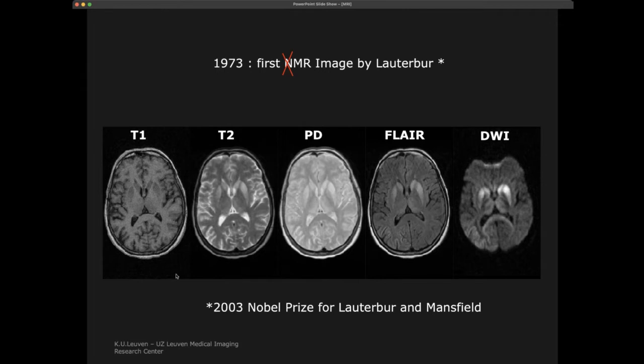What is very typical with a magnetic resonance imaging scanner is that you can produce very different images. While with a CT scanner, in principle, you have one type of image. Mostly you take one image, with contrast or without contrast, of course. You might tweak a little bit with the energy that you're using, but in principle you take one image. Ultrasound also, you take one image, or of course, you can also take Doppler. But with magnetic resonance, from the same object you can take very, very different images, which have actually different information content. And we will see today that there are very important differences.